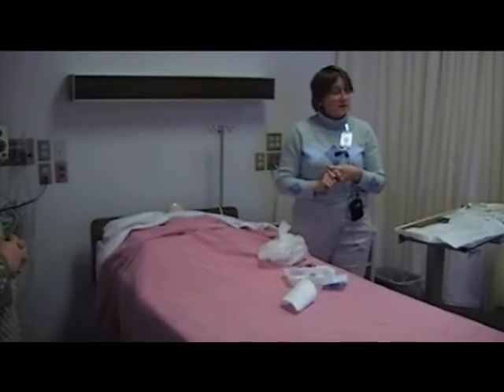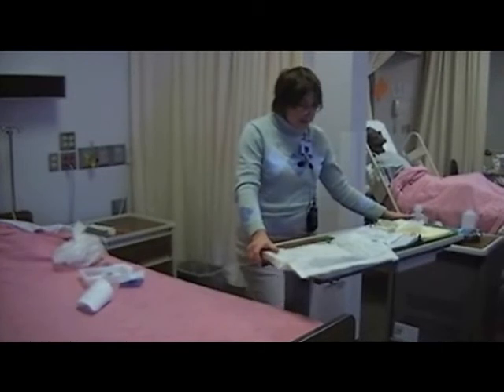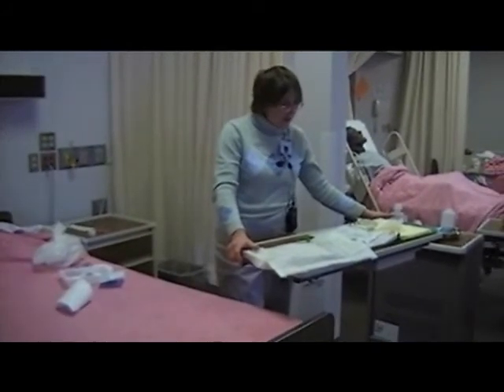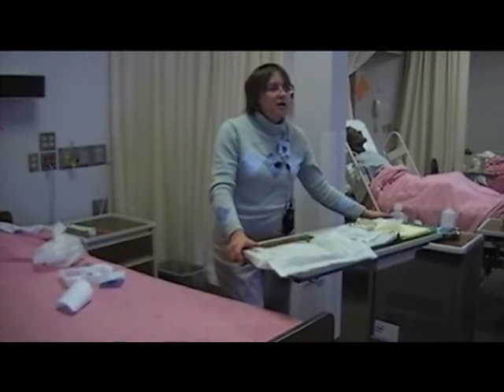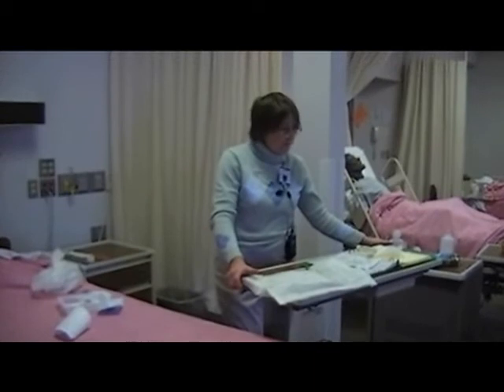30 seconds is the standard, but depending on where you are, their policy may be different, but 30 seconds is the standard. How long will it need to be dried? Once again, usually 30 seconds is the standard, but it may vary. If 30 seconds has gone by and their skin's still looking wet, well, you don't put the dressing on. Wait for it to air dry. Will you ever dry off the area? No. Let it air dry.